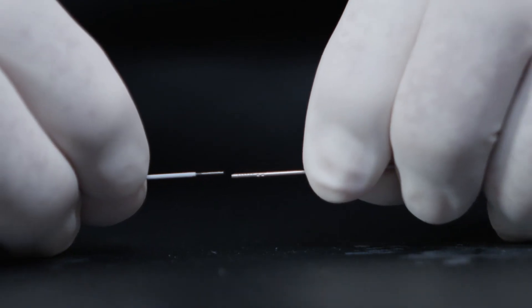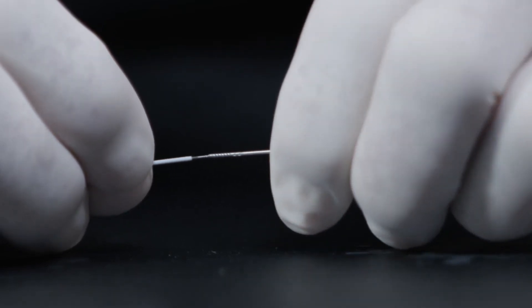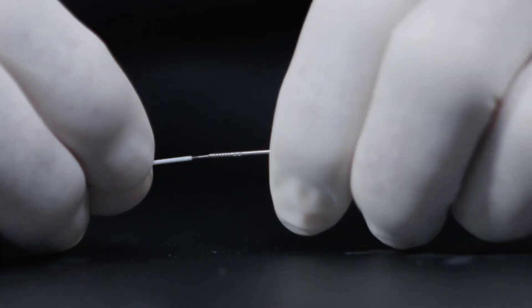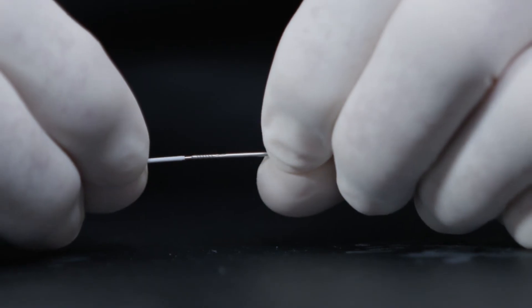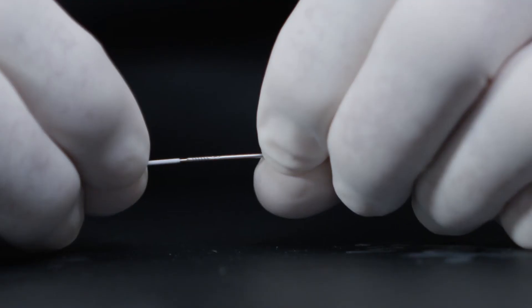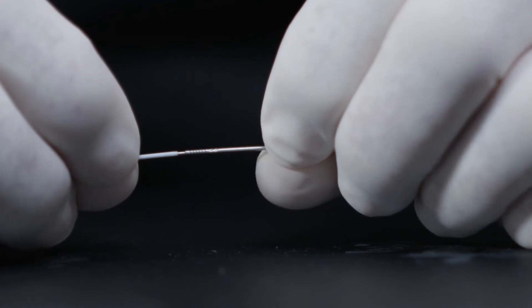To attach the extension device, gently slide the female end towards the male guide wire until the two pieces rest against each other. Rotate the extension device one and one half turns clockwise until the two pieces rest. Gently tug on the extension device to confirm secure attachment. Do not force additional turns, as this may damage your connection point.